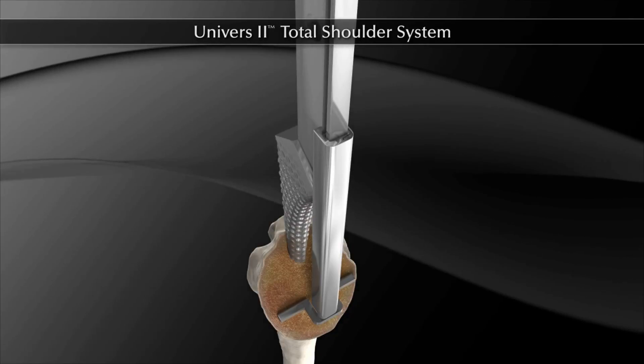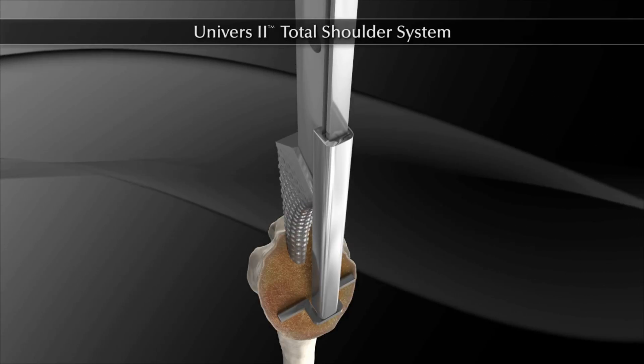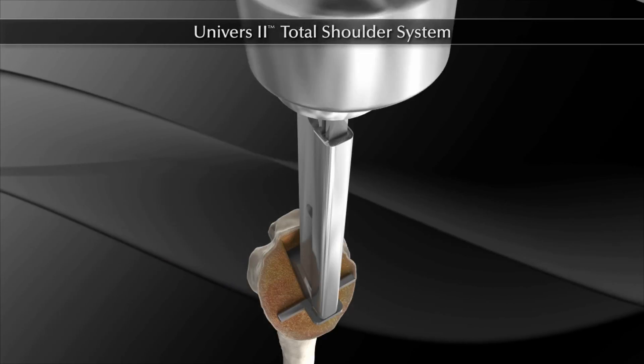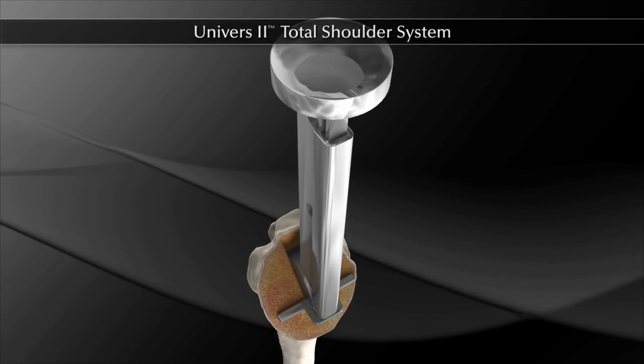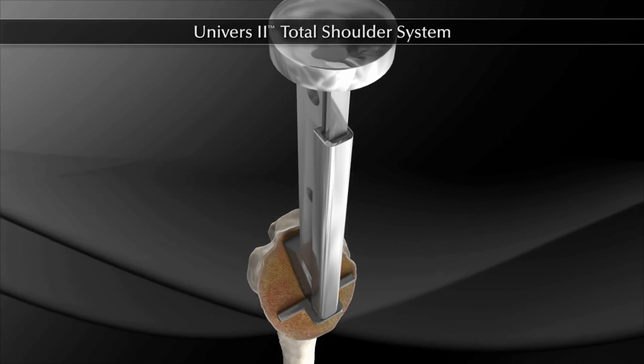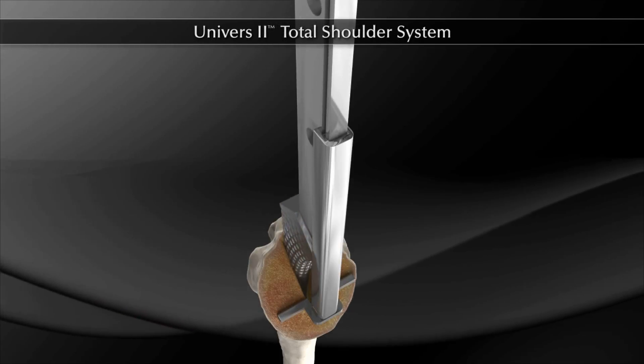The broach alignment guide is positioned onto the 6 mm broach. The broach should be advanced with a mallet until the angled laser mark most parallel to the cut is aligned with the resected surface. The neck-sized broaches are sequentially used until the appropriate fit is obtained.